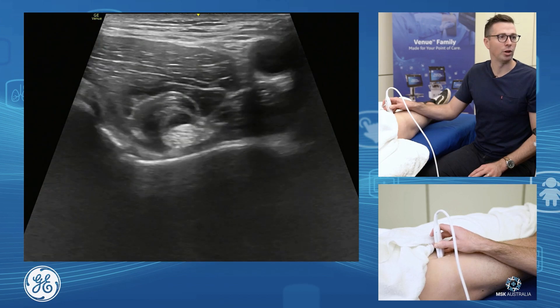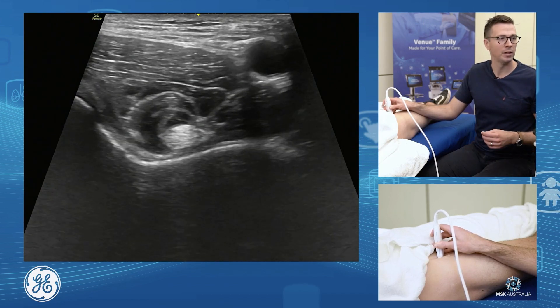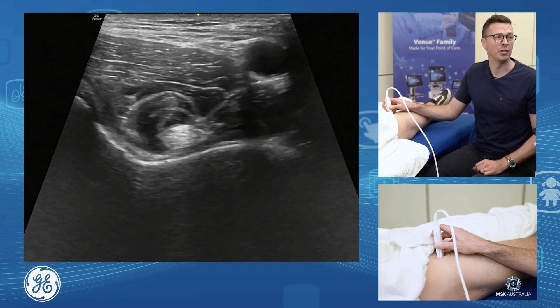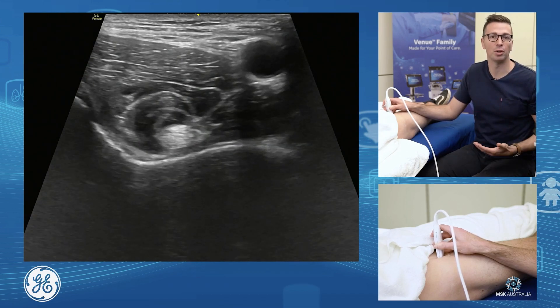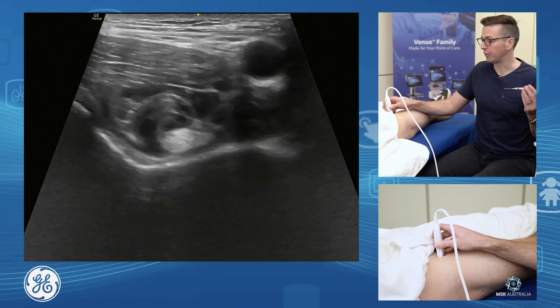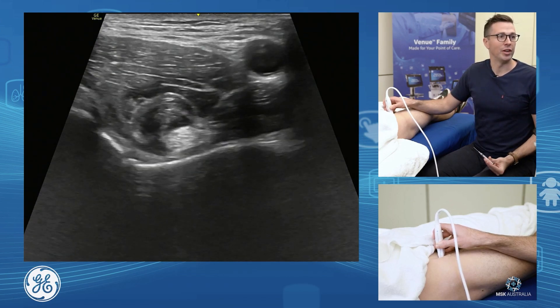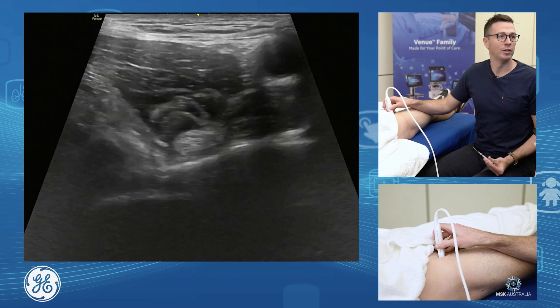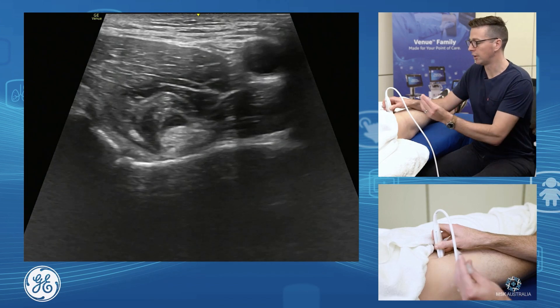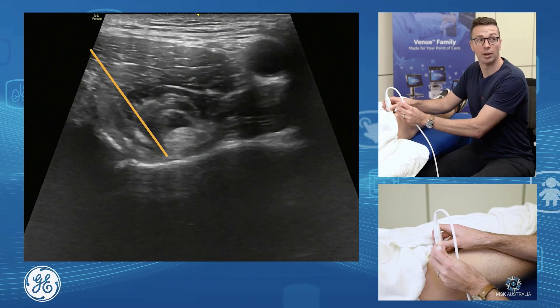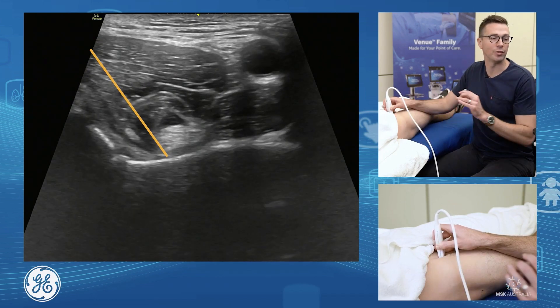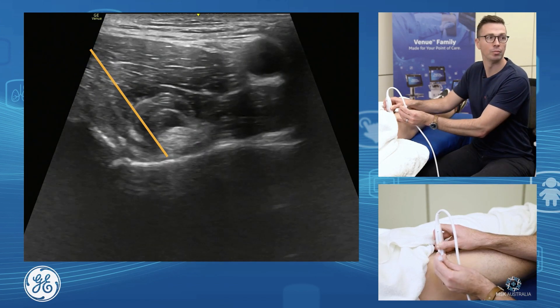This is where we look for iliopsoas bursitis, which is often secondary to hip joint pathology. Remember that the iliopsoas bursa in most cases is contiguous with the hip joint itself — so if you're doing an iliopsoas bursal injection, you're really doing a hip joint injection. For the injection approach: find your iliopsoas tendon at the top, find the femoral head, acetabulum, line yourself up, fix your anisotropy. Bring your needle in at about 45 degrees laterally and slip down to hit the top of the acetabulum, slipping underneath the tendon onto the acetabulum.